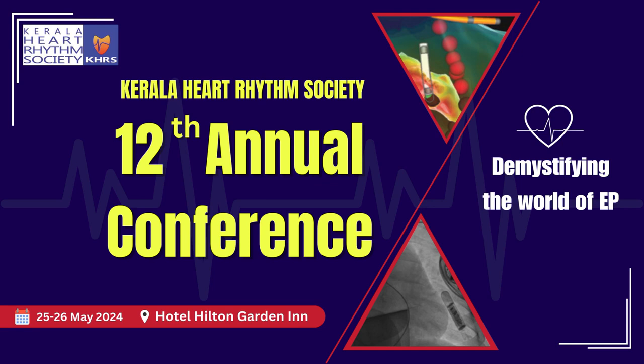Yeah, one last question. When do you consider the septal scar? Yes, sir. Any patient coming for a device will get a cardiac MRI in our hospital, so it's easy for us to get a cardiac MRI. If you find a transmural scar in the basal and mid anterior septum or inferior septum, if you go to that AHA model, the overlapping zone of 2 and 3 and 8 and 9, so the basal and mid inferior and anterior septum overlapping zone, if you are getting a transmural scar, then you will not be able to deploy the lead successfully. It's better to go for a conventional strategy by BIV rather than by left bundle branch pacing.